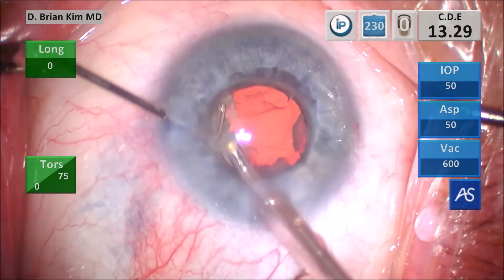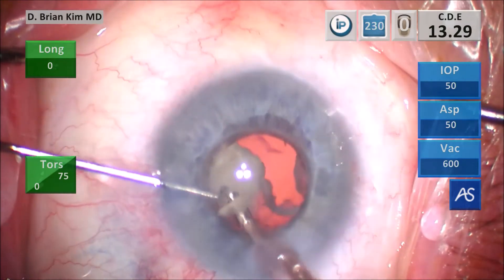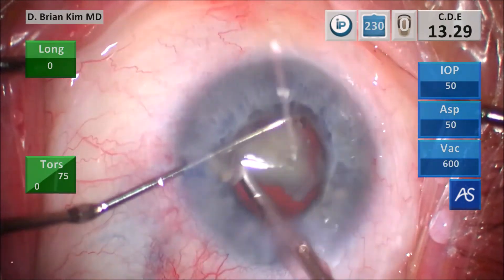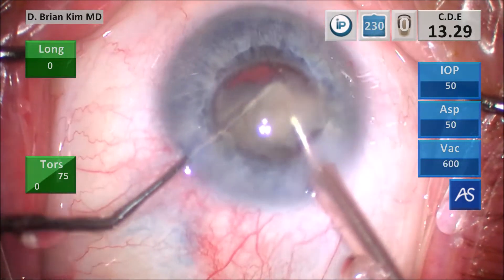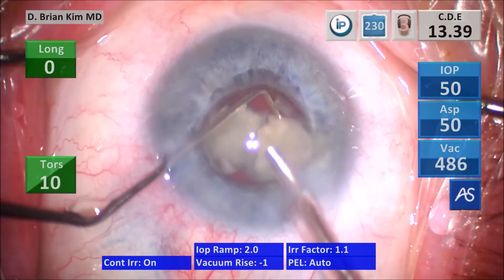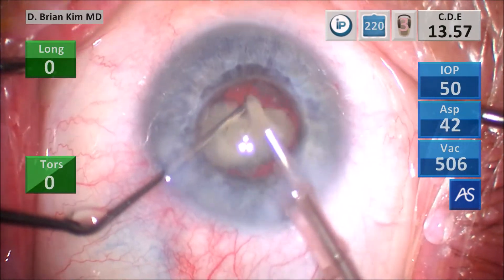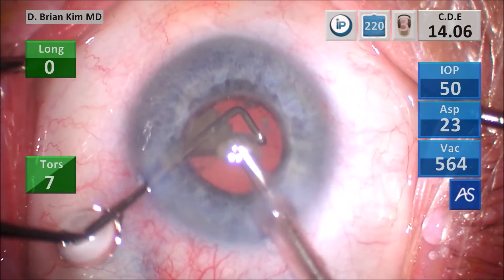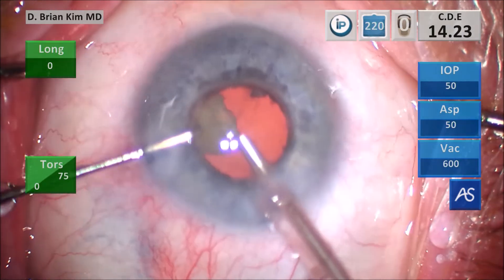That's okay — I ate that piece, pushed some more dispersive viscoelastic to create a wall between the posterior capsule defect and the vitreous and the lens pieces. Now I do this cool maneuver I developed where I basically tease the lens piece up sub-incisionally rather than rotating it in front of me. The typical technique is to rotate that hemi-nucleus in front of me, but if I did that I would push that piece into the posterior capsule defect. Instead I use the chopper and the phaco tip to tease the lens from the sub-incisional space up into the anterior chamber.